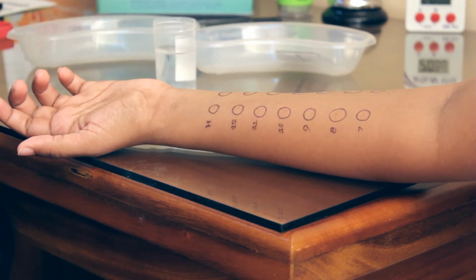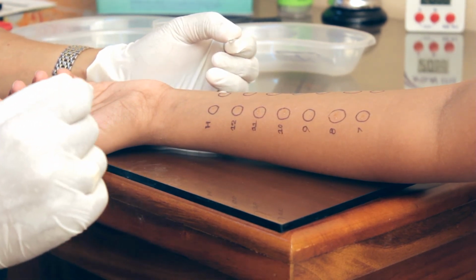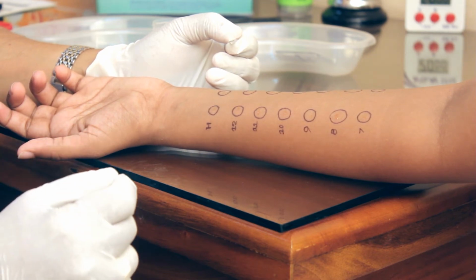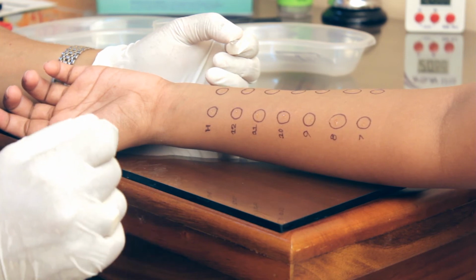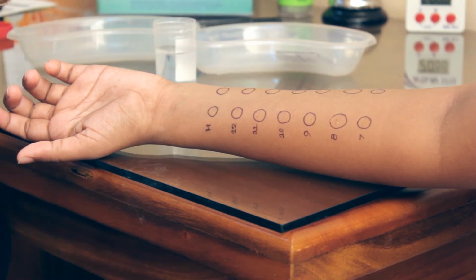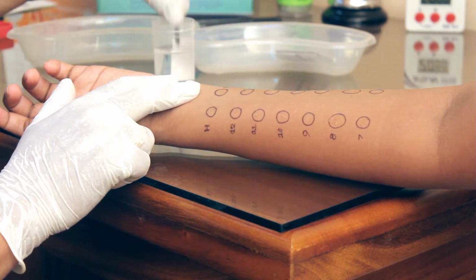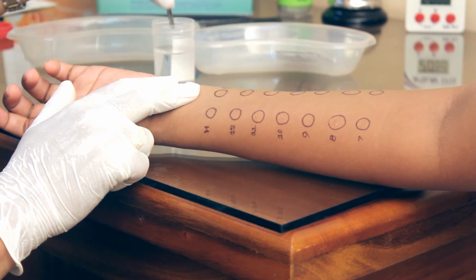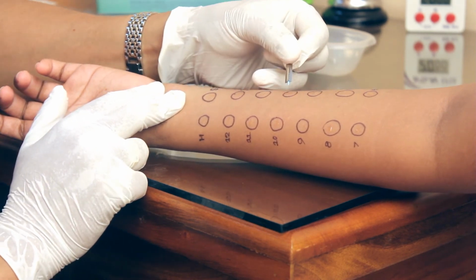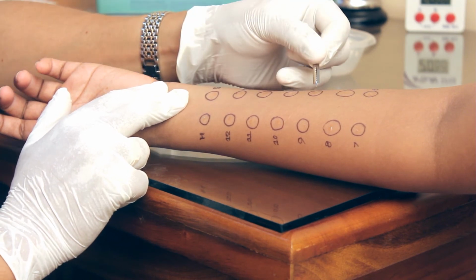So I will start doing the prick, and it is important that you do not prick the skin too deep because it can bleed, and also not too superficial, because then you may not get a reaction. In between the allergens, it is very important that you wash the tip of the lancet, otherwise the allergens can get mixed up.